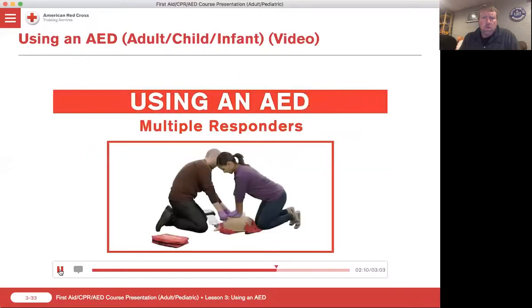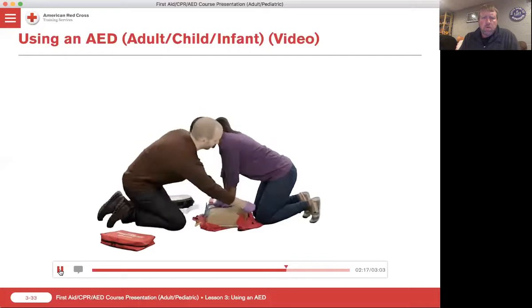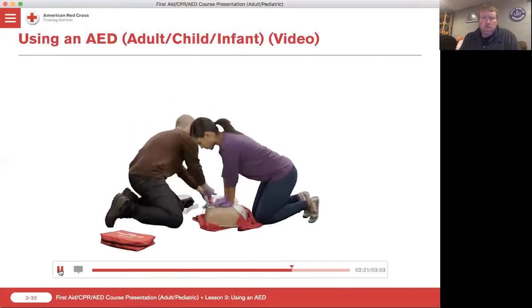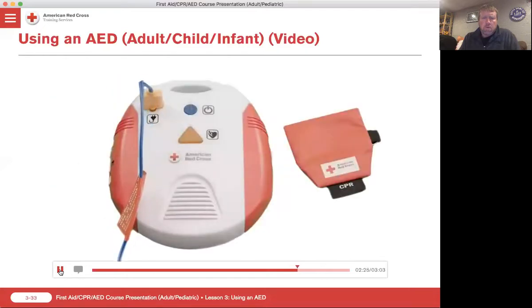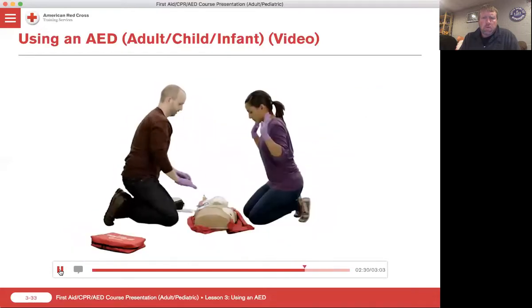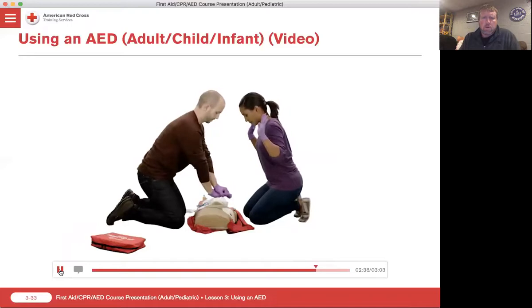If there are two or more responders, the steps will be slightly different. Responder 1 will continue CPR while Responder 2 sets up the AED. When the AED prompts analyzing heart rhythm, Responder 2 says clear. Then the responders switch roles — Responder 1 will now operate the AED and Responder 2 will now provide CPR. The responders should switch roles in this manner each time the AED analyzes the heart rhythm.